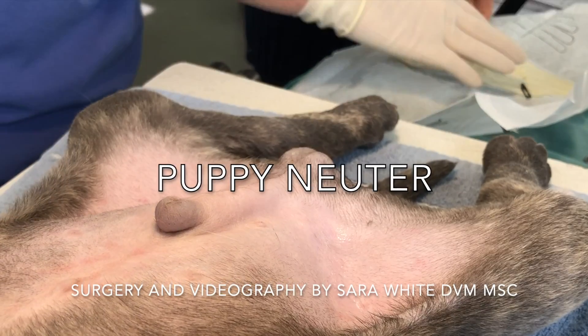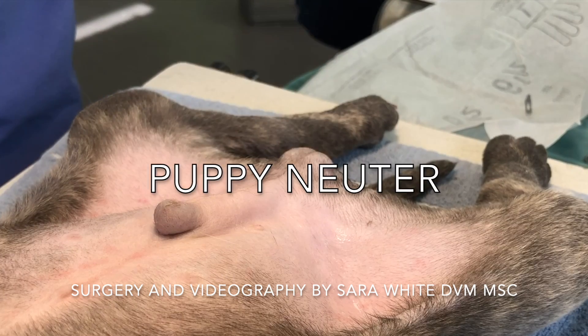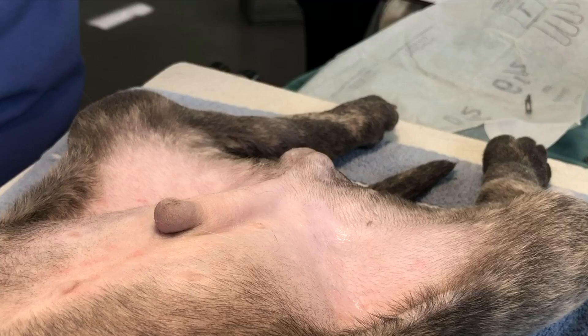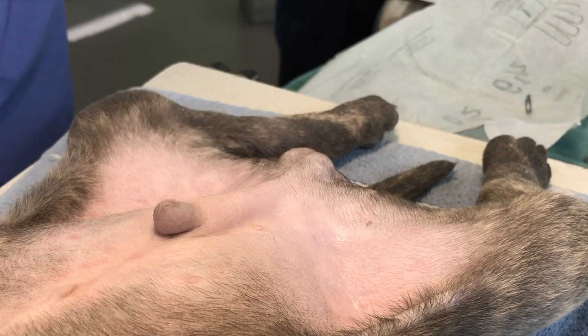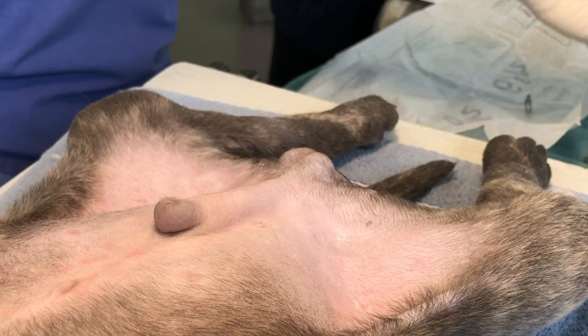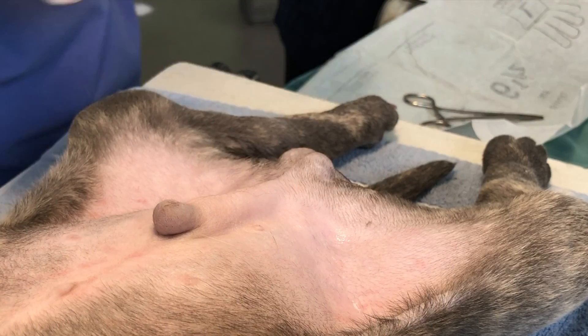Puppy Neuter. The puppy in this video is a mixed breed shelter puppy about 10 weeks old. He's been clipped and surgically prepped. The surgeon wears sterile surgical gloves and uses sterile hemostat and blade for this surgery. This technique is suitable for young puppies. Many HQHVSN veterinarians use this technique in all puppies whose testicles are equal to or smaller than an adult tomcat's testicles.